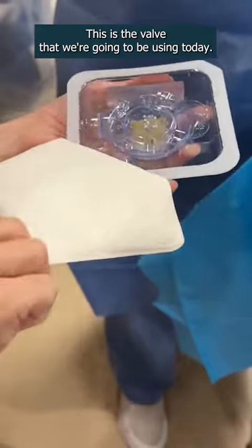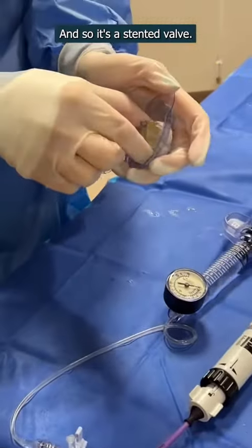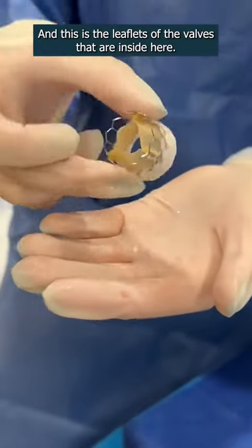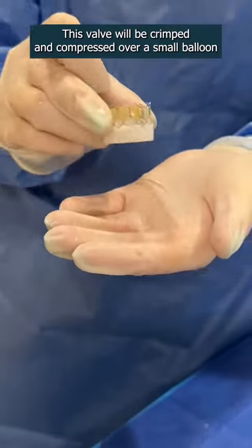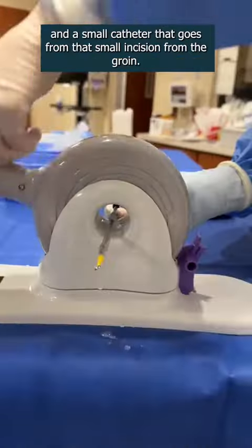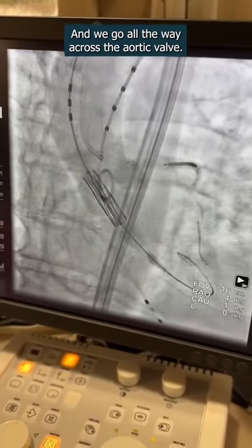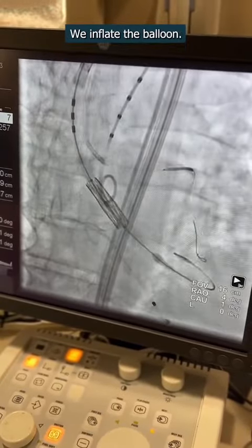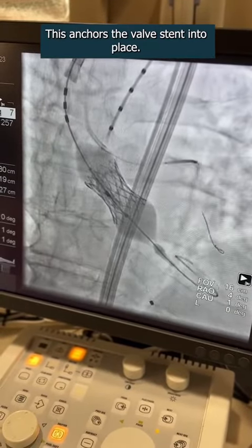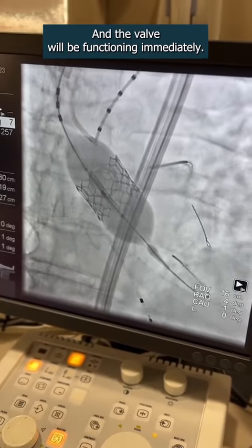This is the valve that we're going to be using today. It's a stented valve, okay, and these are the leaflets of the valve. They are inside here. This valve will be crimped and compressed over a small balloon and a small catheter that goes from a small incision in the groin, and we go all the way across the aortic valve. We inflate the balloon. This anchors the valve stent into place. We leave the valve in and we take everything out, and the valve will be functioning immediately.